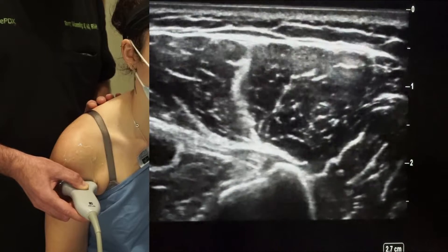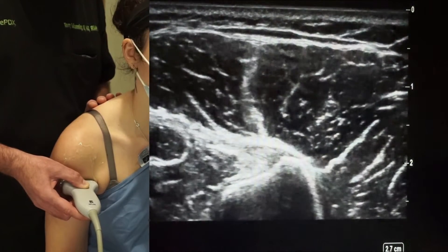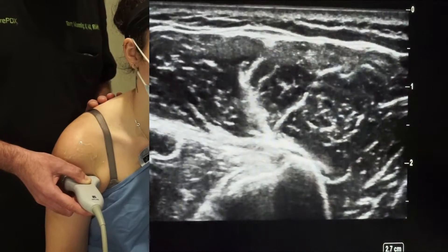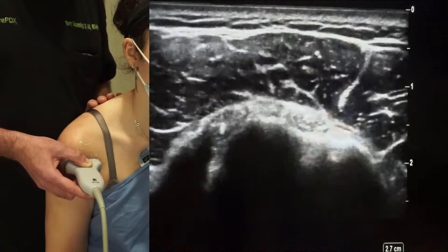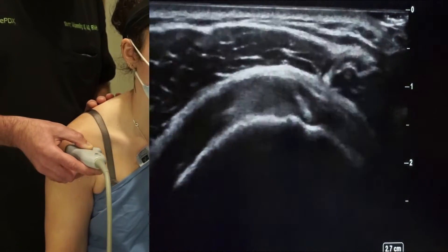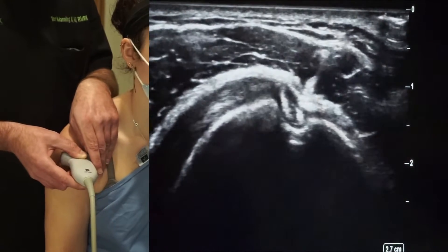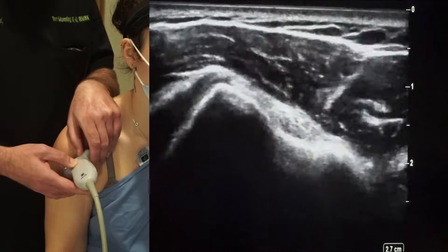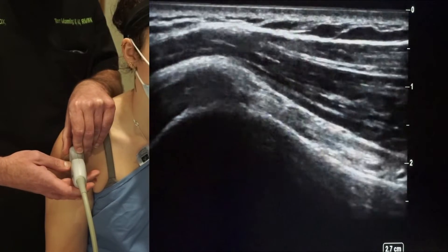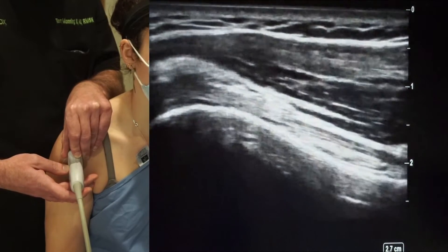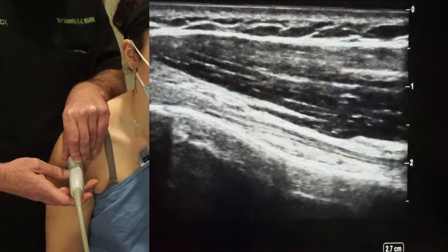For the biceps tendon, we go down here to the pectoralis major insertion on the humerus, and the biceps tendon is deep to that. We follow it up along into the bicipital groove and then into the rotator interval, scanning everything in two planes. Here we're short axis on the biceps tendon, then we rotate the probe 90 degrees and go long axis on the tendon so we can see the tendon sheath in better detail and make sure we don't miss any fluid accumulation.